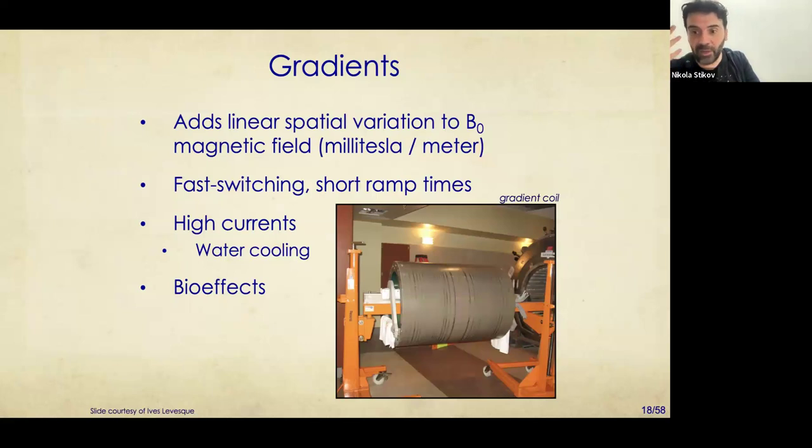Basically, that's the fluid that you have, the liquid, the cerebrospinal fluid. So as you're shaking your head, you're basically moving a conductor in a magnetic field, so you're inducing a current. That current will affect many of your neurons in your head, in your brain, including the inner ear neurons. So that makes you feel dizzy.